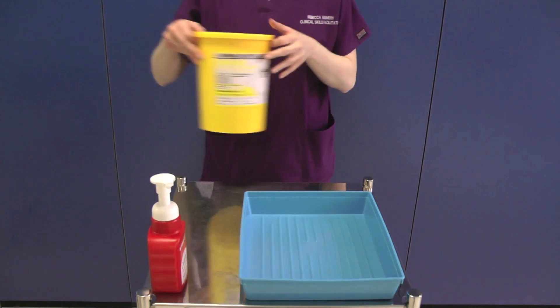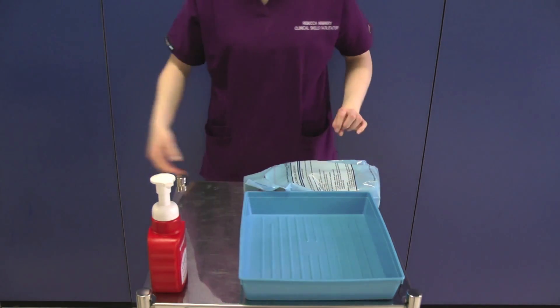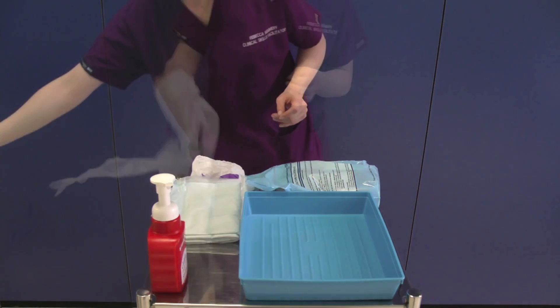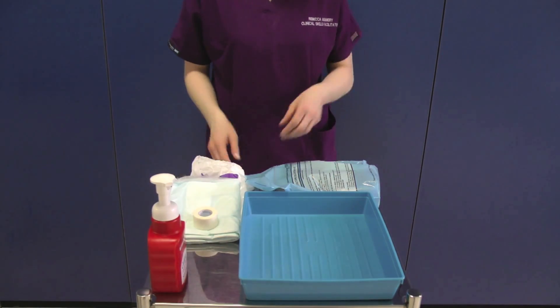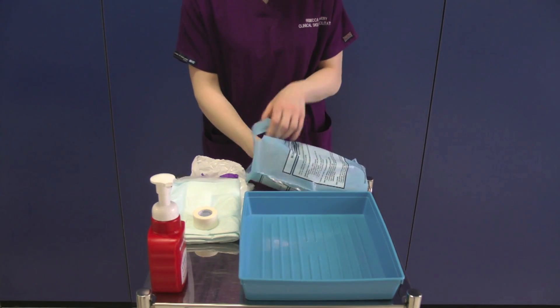Gather the equipment onto the trolley, making sure there is a sharps bin to hand. Do not put the unopened equipment in the tray at this point. Open the blood culture pack and arrange your equipment in the tray, ensuring all key parts are protected.